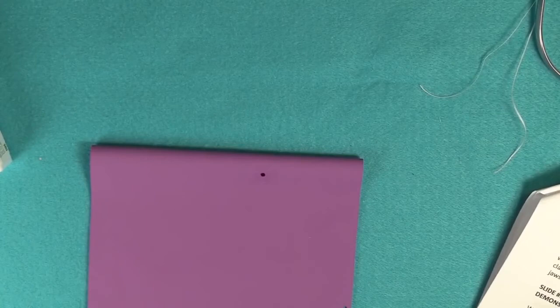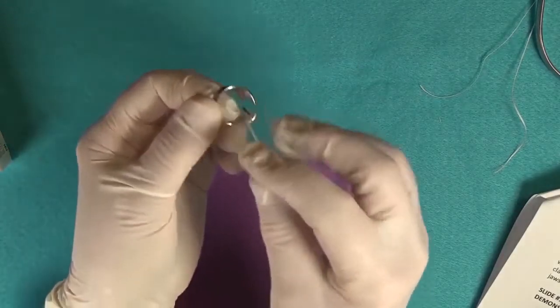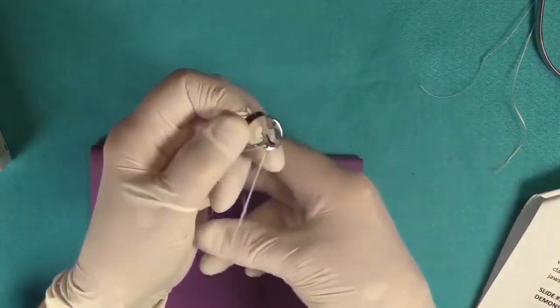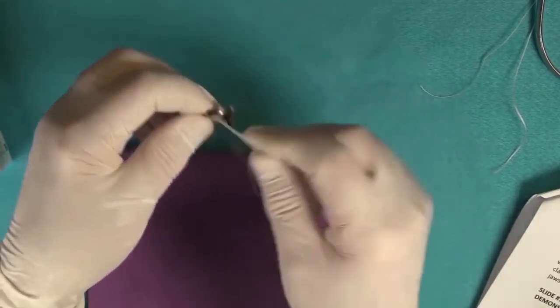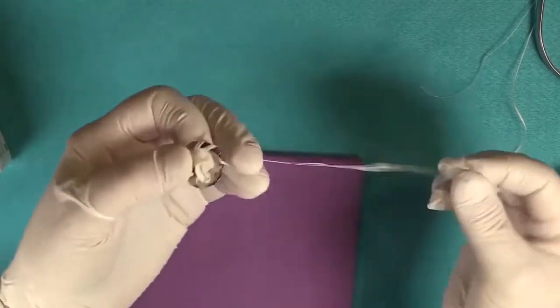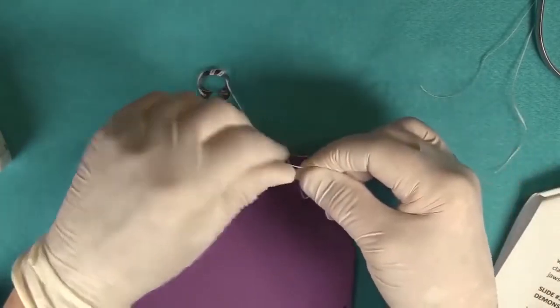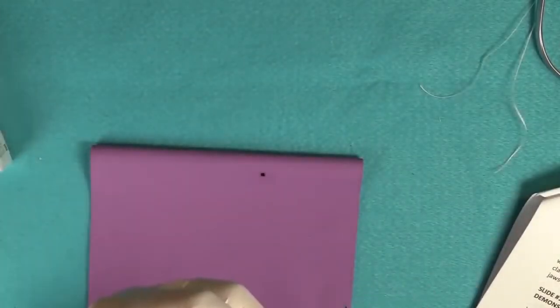Of course, it's really important to use your ligated or safety-flossed clamp, particularly when you're using your wingless clamp, because you have more of a chance of it coming away from the dam. So we're going to do the same thing. Again, we're going to thread it on the lingual, put the floss through the loop, and wrap one, two, three. If you come from bottom to top, you'll see why I do it that way when we use the wingless clamp, because it's easier to retrieve the floss and bring it to the surface.